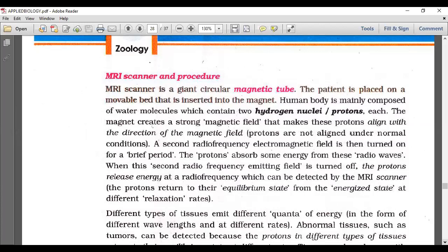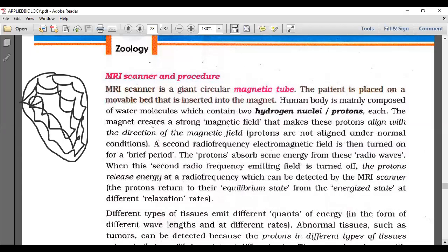For example, a particular organ for which we are taking an MRI. Generally the cells are present like this. For example, there is a cancer. When they are present like this, we get some MRI picture. But imagine the picture we got here is something else. Imagine in that particular organ or tissue, tumors have developed.